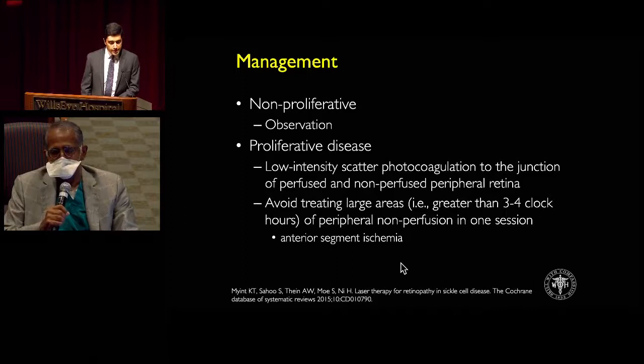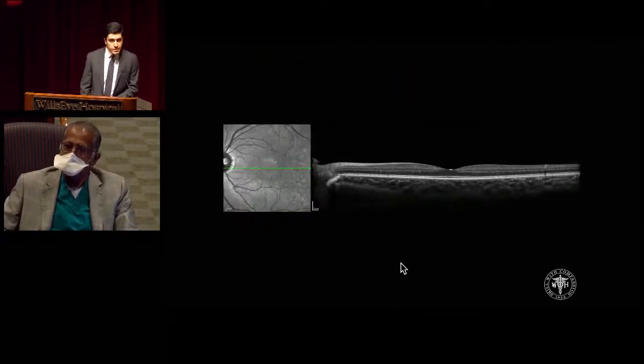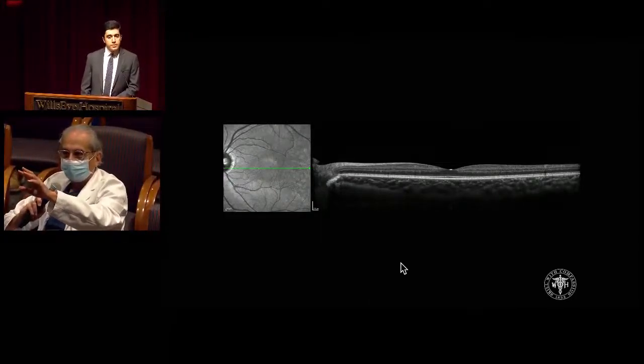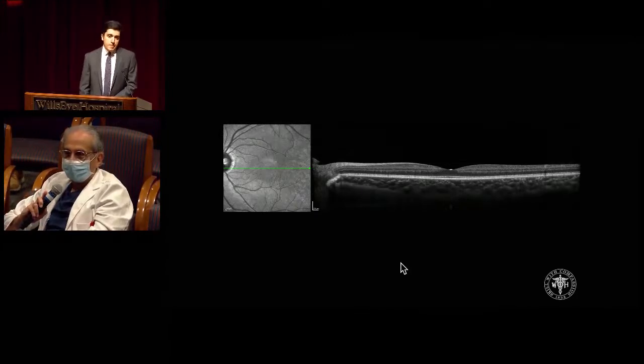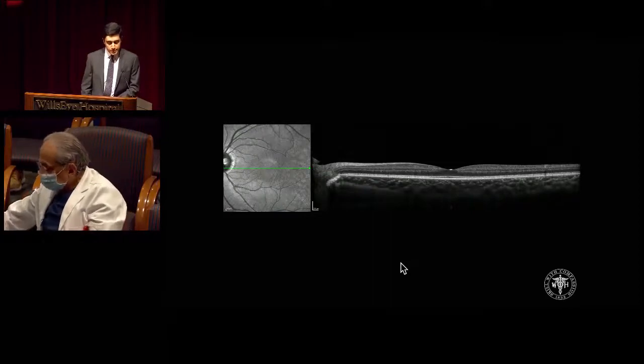Right, okay. And, go back to the OCT. How old is this patient? 20. So the question is whether there should be any nerve fiber layer temporally or not. And it's always very attenuated, so it's always a difficult call. But it does seem like for a 20-year-old, that is thinner than the usual. Yeah, that's a very good point. Okay, thank you very much, everyone.